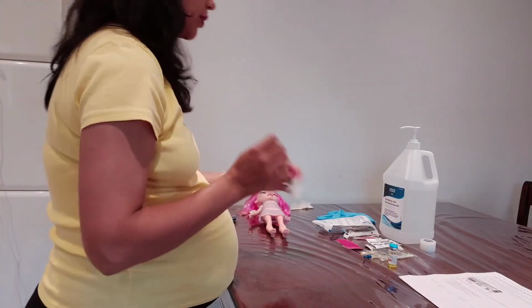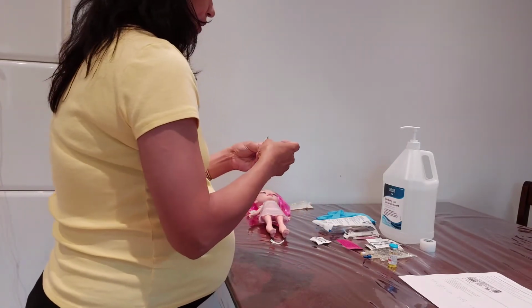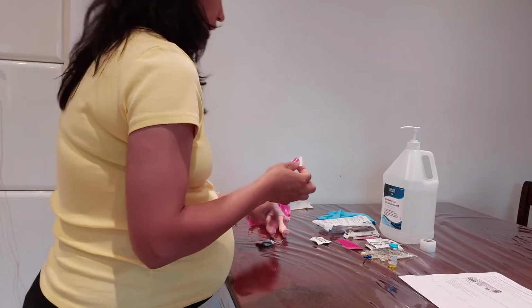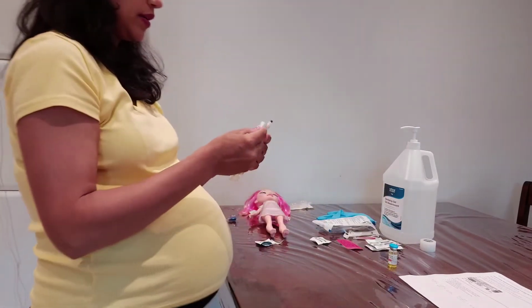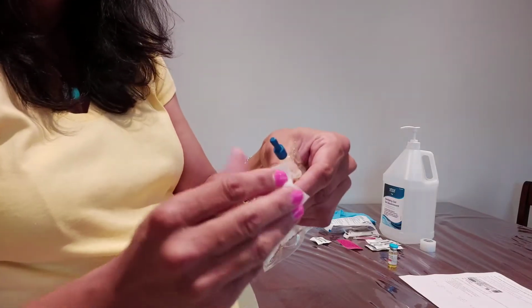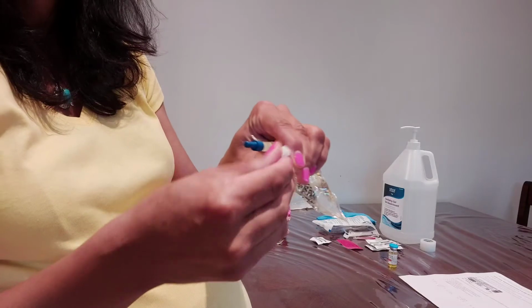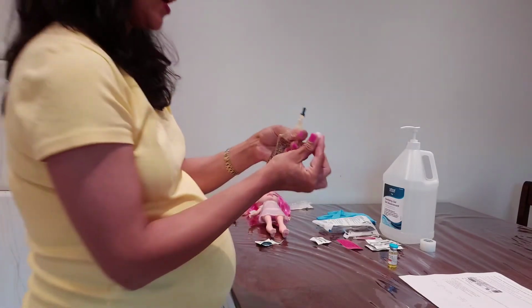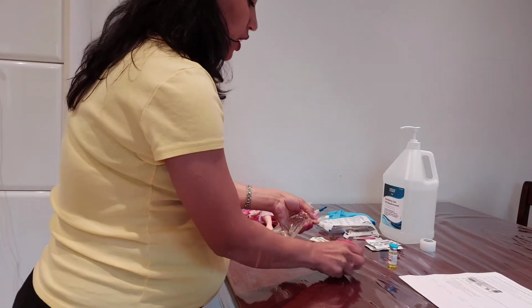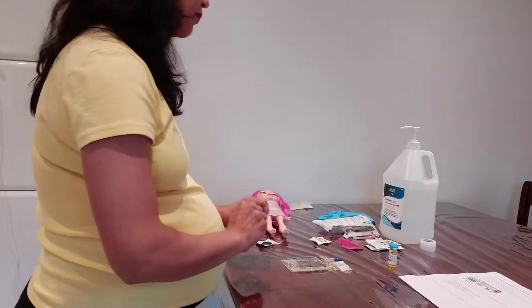First, I'm going to clean the mini bag. I will clean this here for 15 seconds. I will put the swab here in order to prevent any contamination.